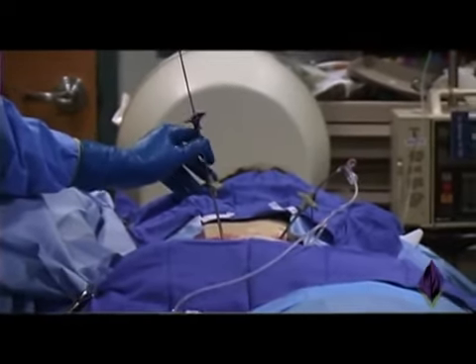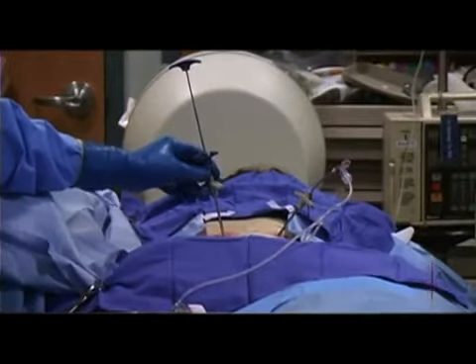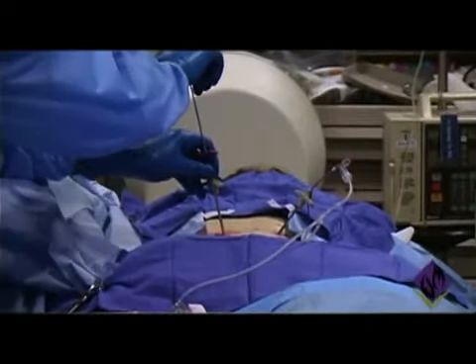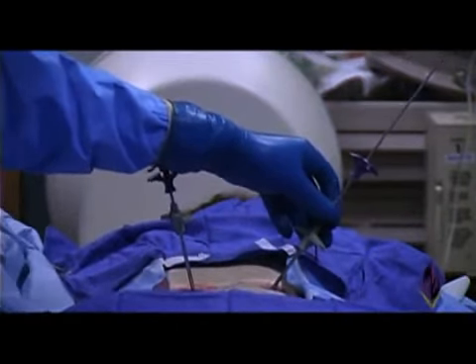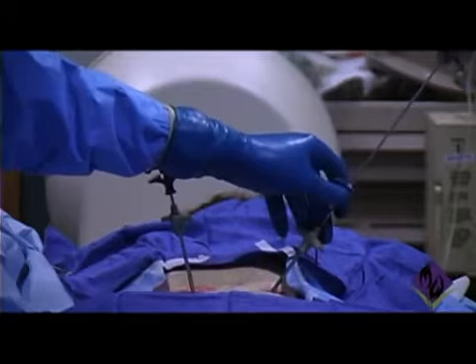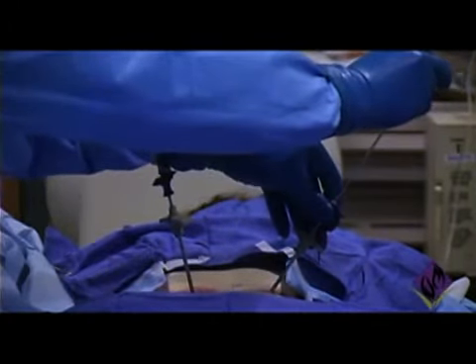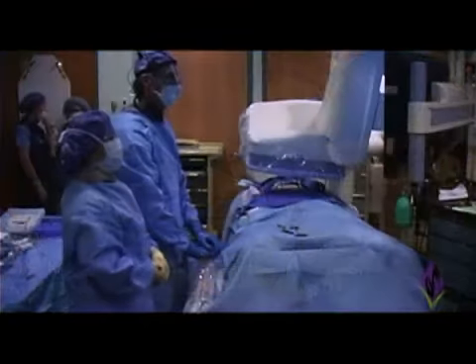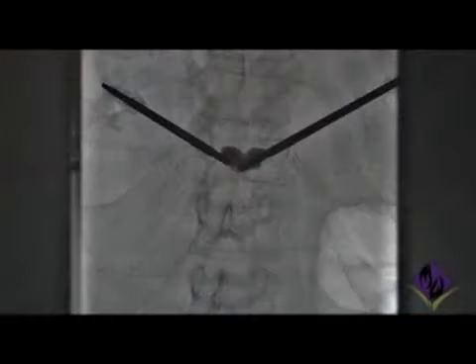Now I'm going to put the bone filler in. Now putting the bone filler on the other side. And you can see that the cement is well positioned in the center of the body. And it's really fairly symmetric. It's covering both sides equally.